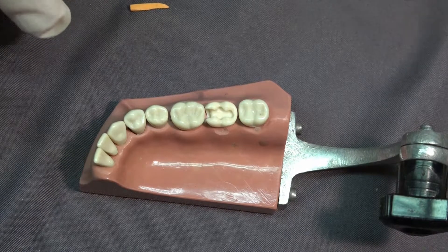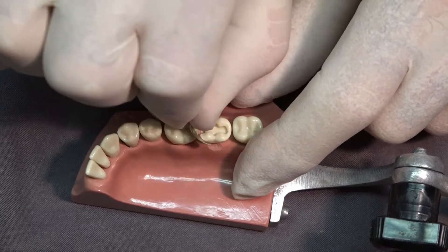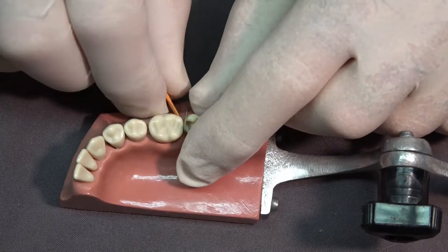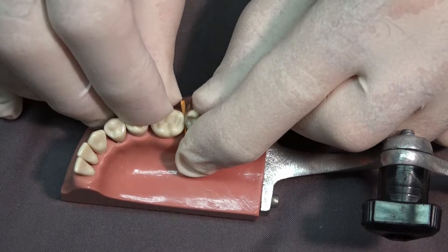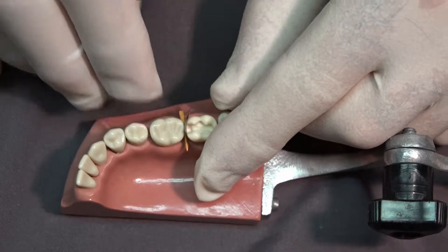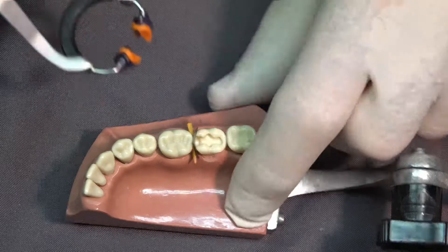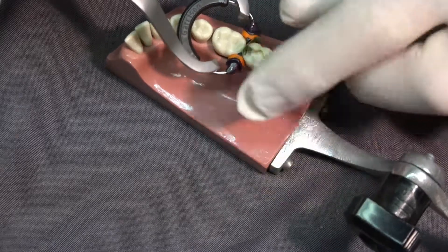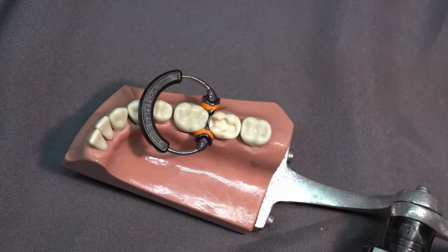We've cut our cavity preparation. We're now going to take a sectional matrix, place it in between the teeth and wedge it as we normally would, then take our matrix clamp and clamp that.